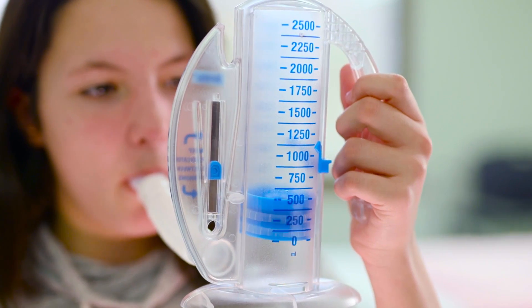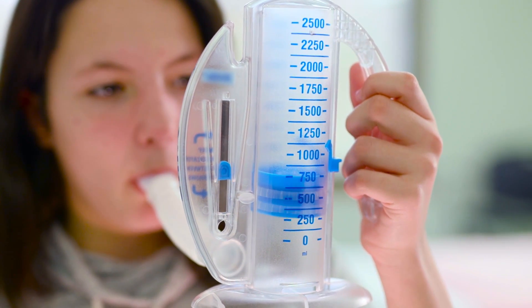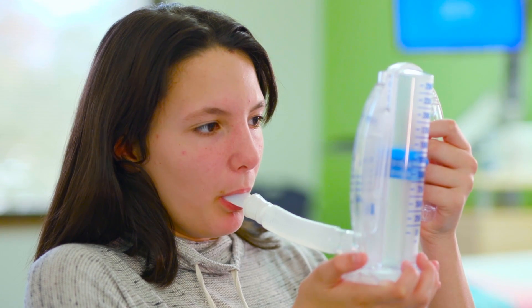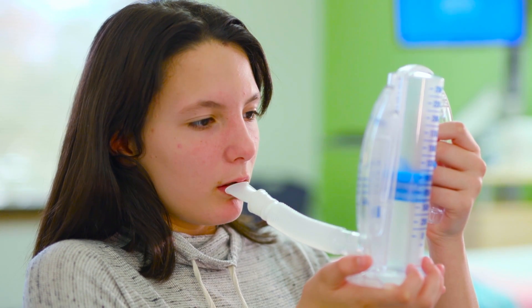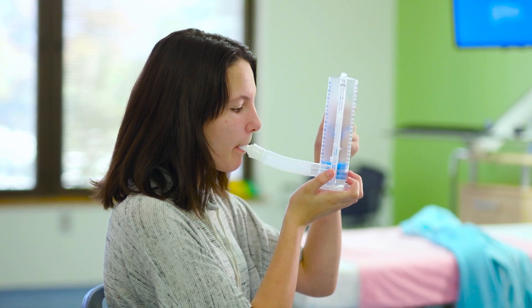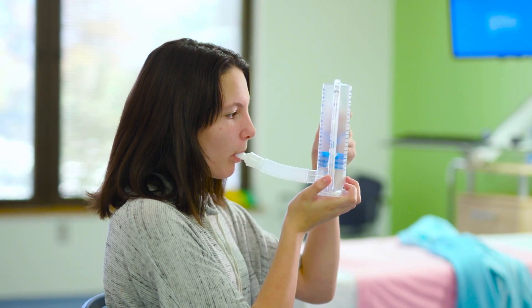Breathe slowly enough to keep the ball in your target zone, and breathe deeply enough until the piston gets to the mark your care team has set for you. Hold your breath for three seconds, then let it out slowly. It can take a few tries to hit your mark. Your care team will let you know how often to use the incentive spirometer.